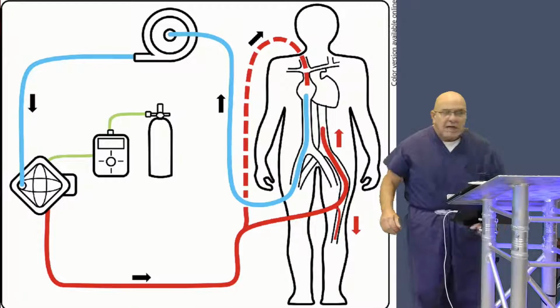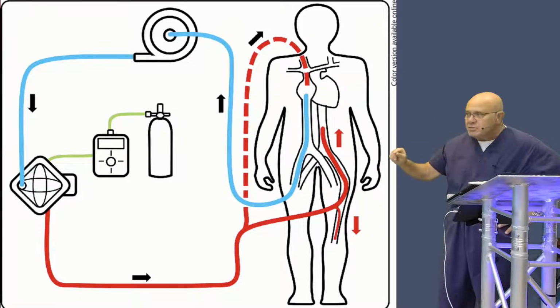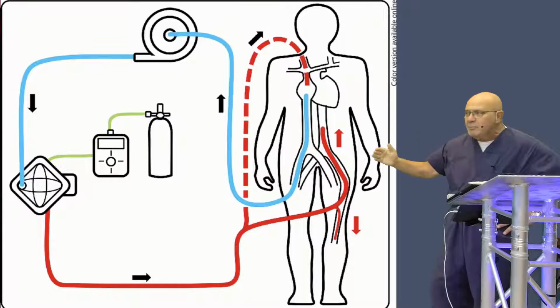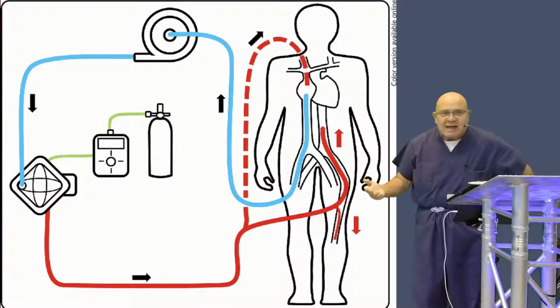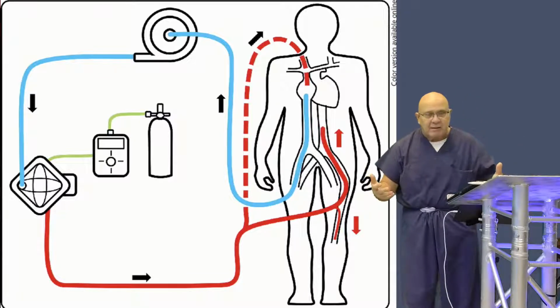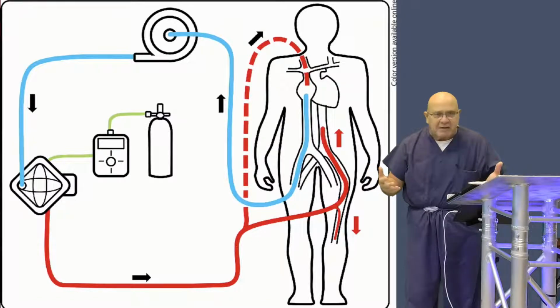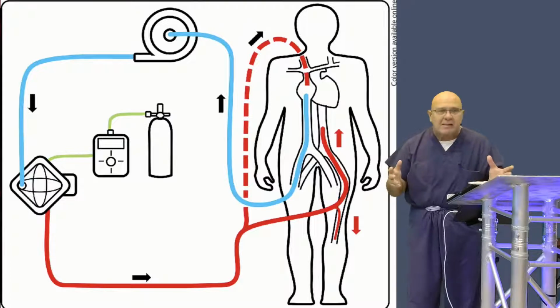So we really only have two choices. Choice A is to reduce the Impella flow. If we reduce the Impella flow, then our ECMO flow will make its way further up and around. But that's not necessarily a great idea because you saw that chest x-ray with the heart being extremely dilated. And that heart doesn't need to be any more stuffed. It's not going to benefit that patient at all. So lowering the Impella flow is probably not the best option.